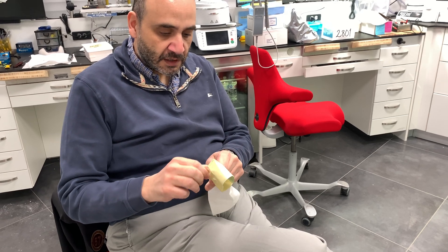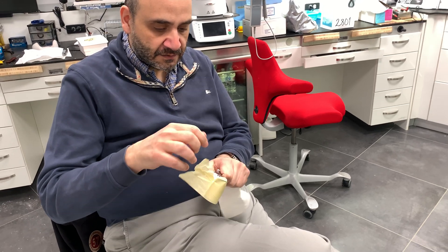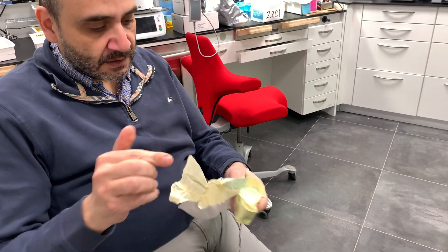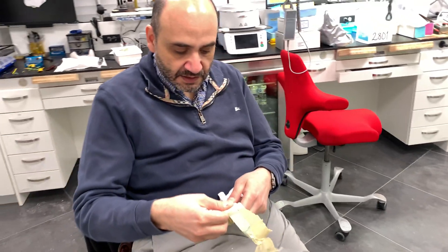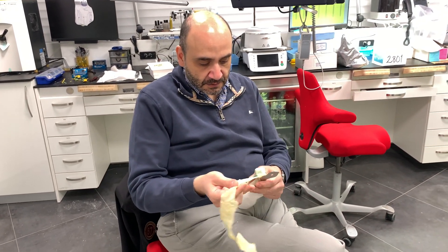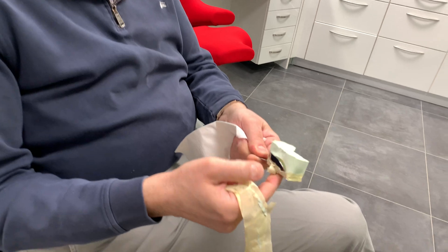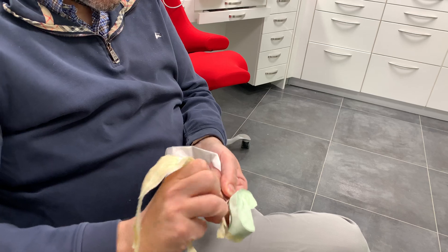This just happens to be an impression of a single unit restoration, tooth number 47. You always want to attach your tape onto the metal rim if you can — it's more efficient than attaching it to the impression material, and it comes off pretty clean.